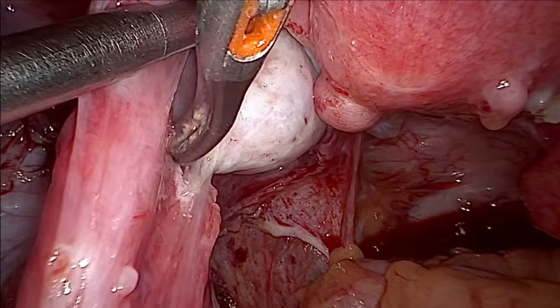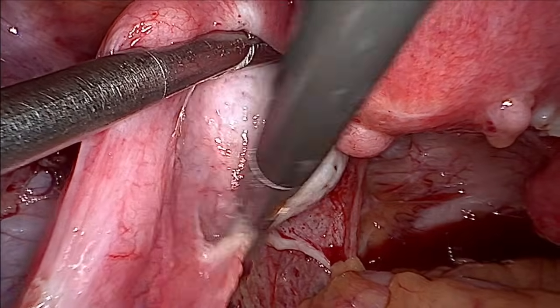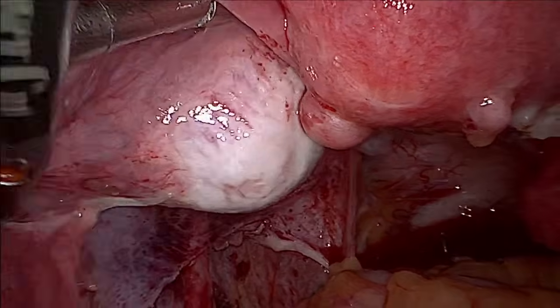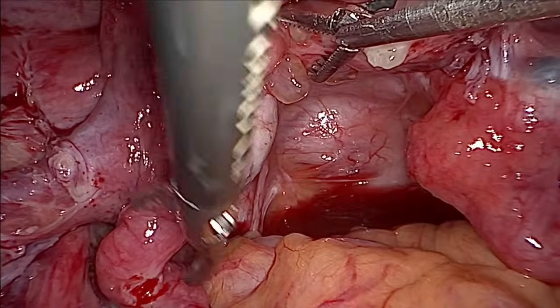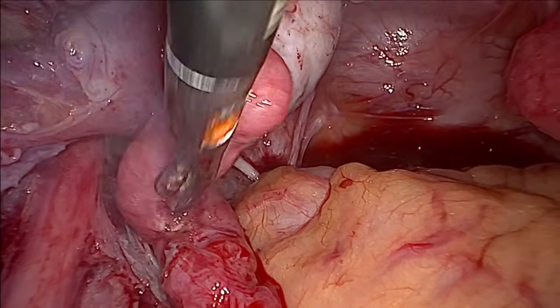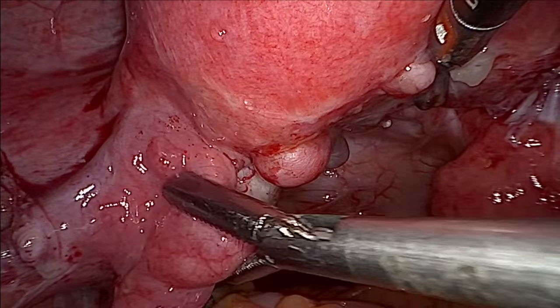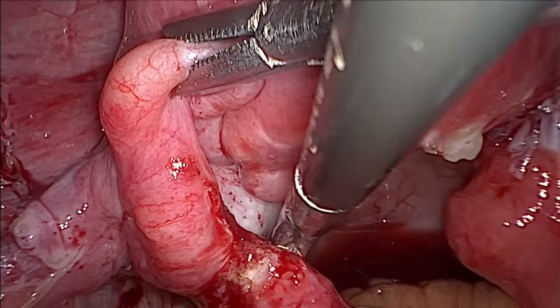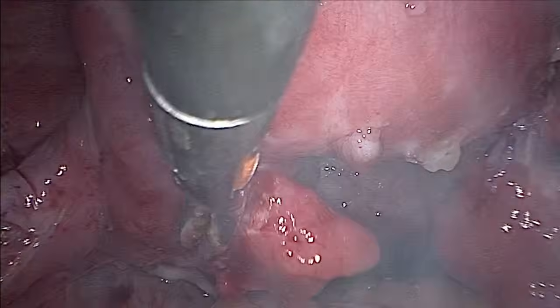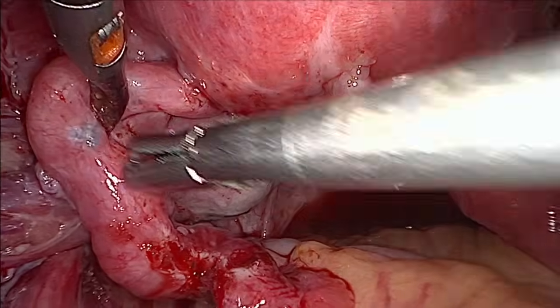Try to release these adhesions here. You can see the tube is normal here. The tube has been released, but you can see the small endometriotic spots here.